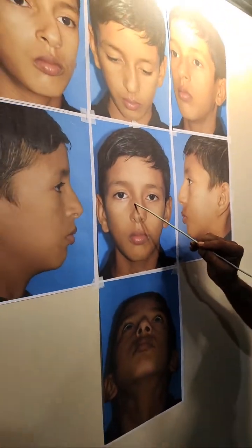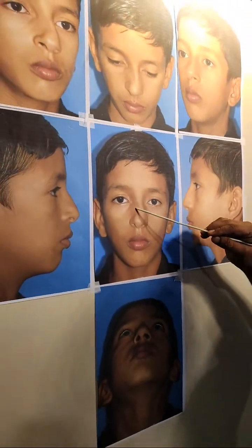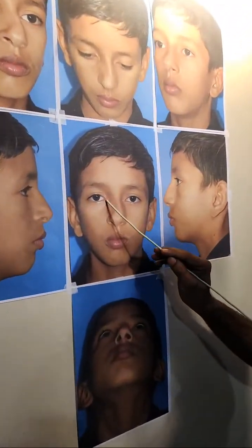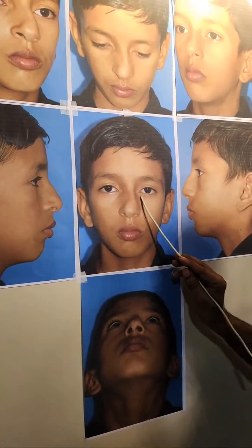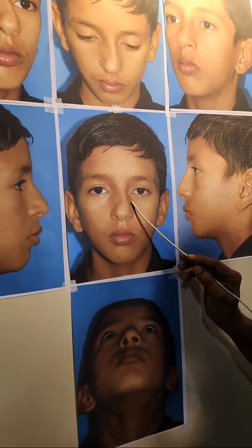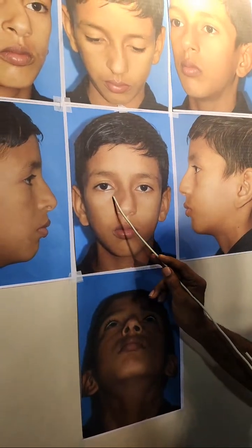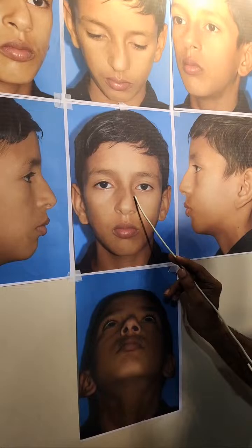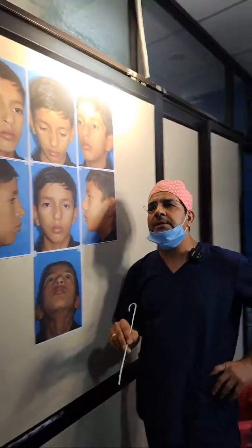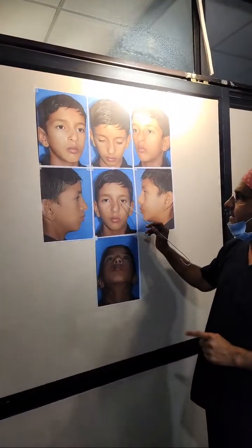So this side is the concave side, this side is the convex side. First you do the osteotomy on this side. Why? Because first you free this lateral nasal wall, and then this nasal wall mobilizes after the osteotomy. Otherwise, if you do the osteotomy on this side first, then it's very difficult to mobilize the convex side, because the concave bone resists mobilization. So in such a patient, the sequence of the osteotomy is important. On the concave side you do the osteotomy first, and then the convex side later.